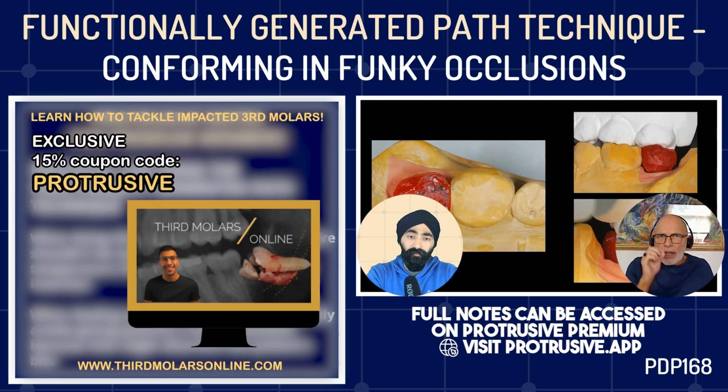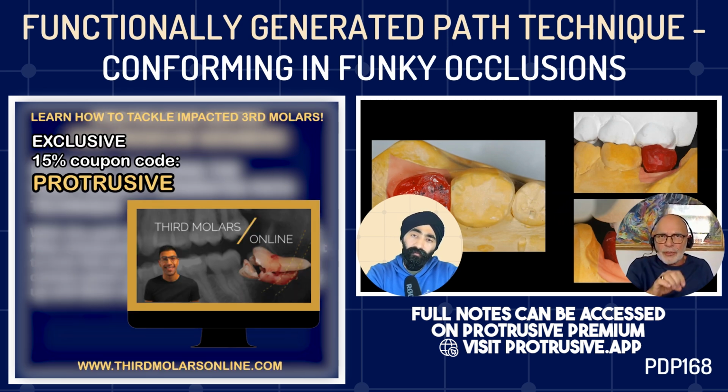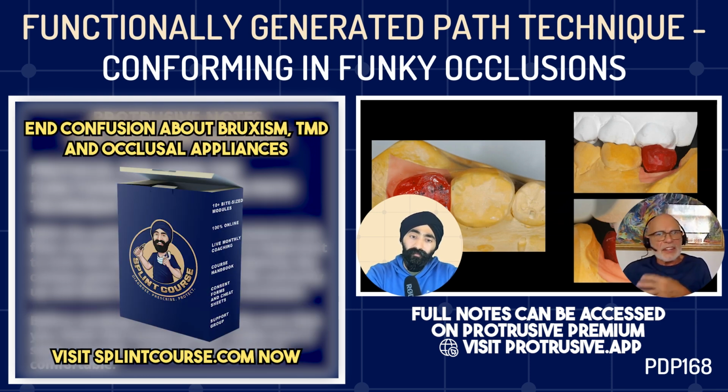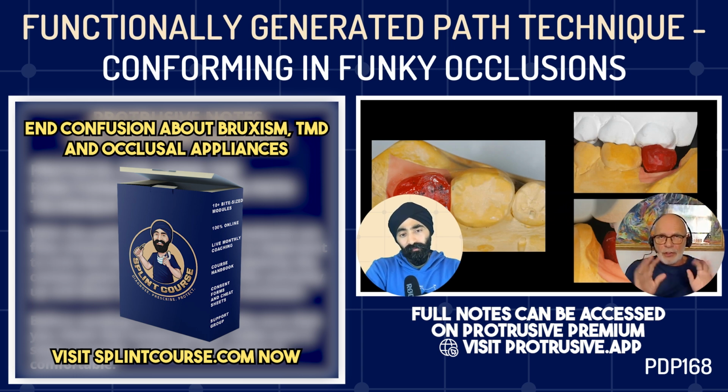And yes, you're correct. It can flow interproximally. That's why you have to take the hat off, trim it a bit, but not destroy your contact point, and make sure it fits correctly up and down and it fits with the patient's occlusion. You don't just do it and then send it off. You have to check the contact points, make sure it seats correctly, and make sure that the patient goes, yeah, that's fine, that's really comfortable.